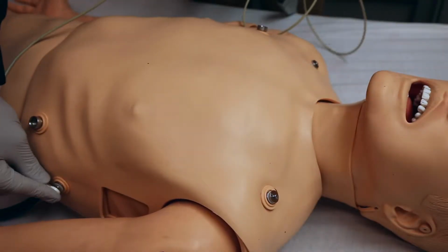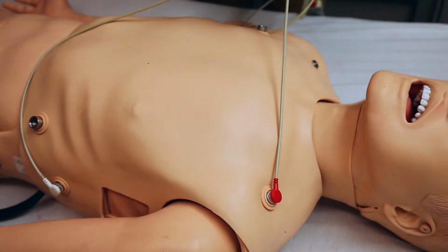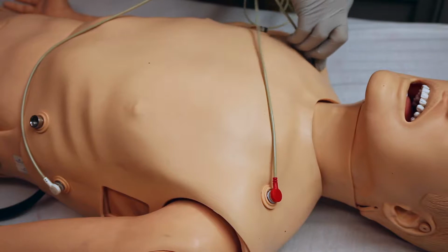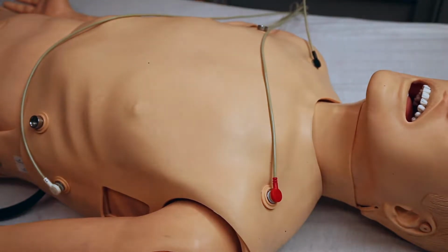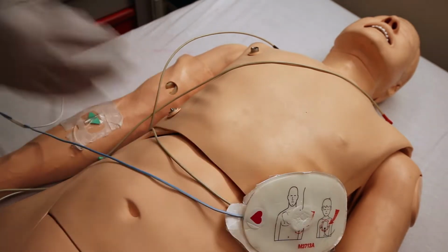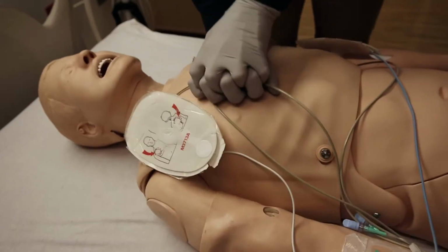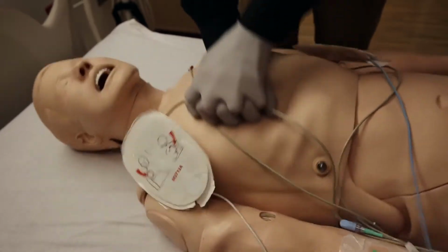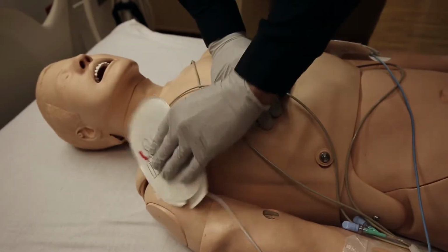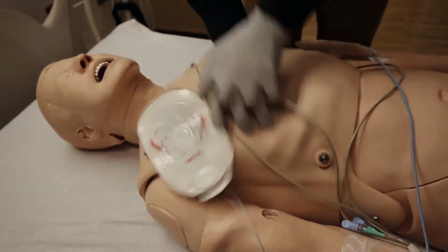Defibrillators can be used on the patient simulator. ECG leads do not need stickers to attach. The mannequin has pre-placed connection studs where a 3-lead ECG can be placed. The same is also true with defibrillator pads. Pads will snap onto the mannequin. These pads can easily become disconnected, especially when performing compressions. If you notice one of the pads come off during the simulation, just snap it back on.